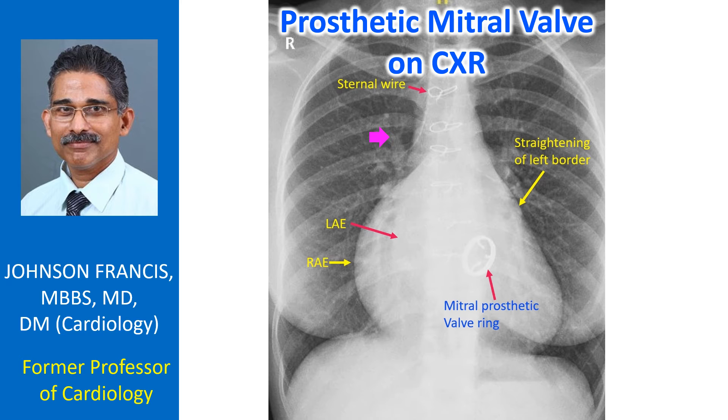From the X-ray alone, we are not sure whether there is paraprosthetic mitral regurgitation which is causing biatrial enlargement and pulmonary venous hypertension.